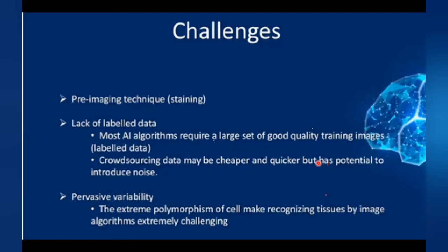And all tumors cannot be taken up for AI at the present moment. There are cells like some sarcomas with a marked polymorphism that can create a difficulty in AI because the algorithms do not actually yield the correct results. So there are still challenges in tumor tissues.